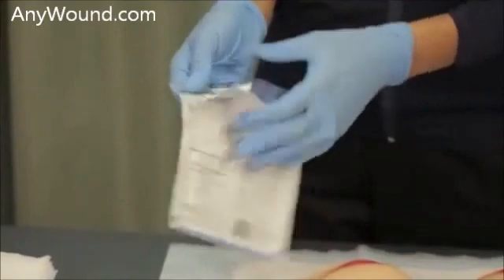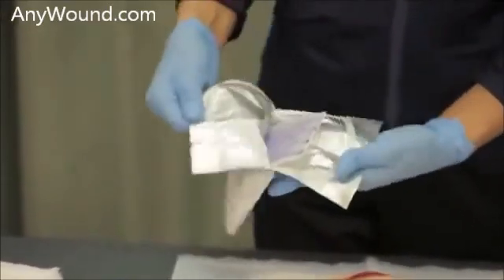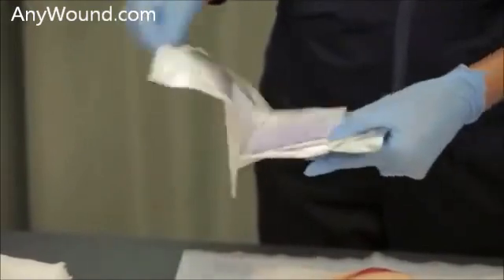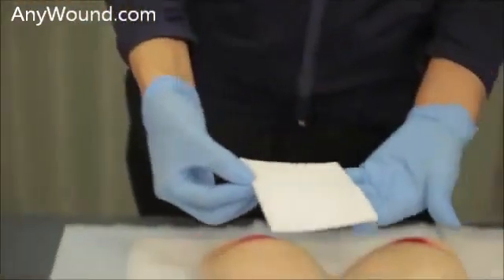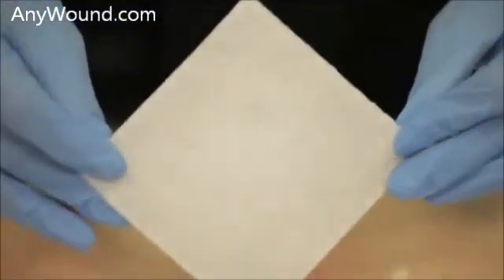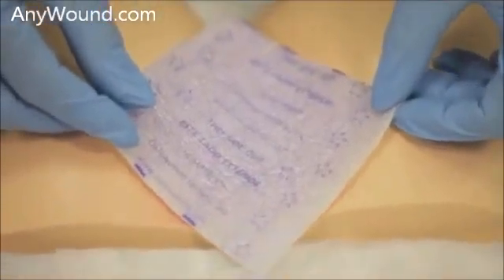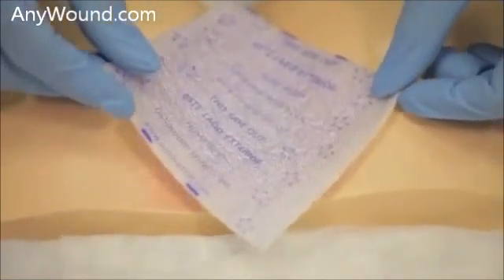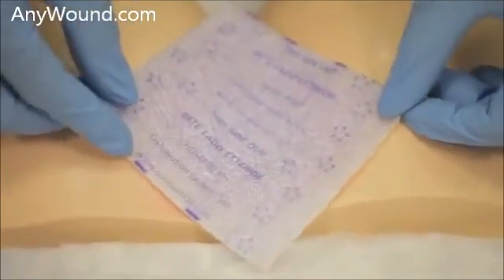Once you open it, you will open and just touch the edges of the dressing. This is the dressing — the fiber side will be towards the wound side. You will place it along, making sure that you cover any of the external red peri-wound area.